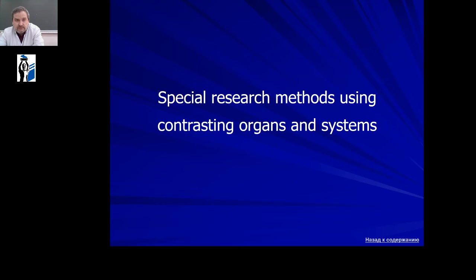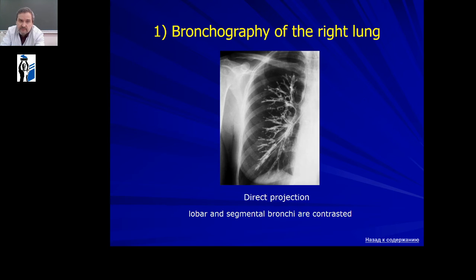We are going to special research methods using contrasting of organs and systems. And we will view some types of special X-ray diagnostic techniques.